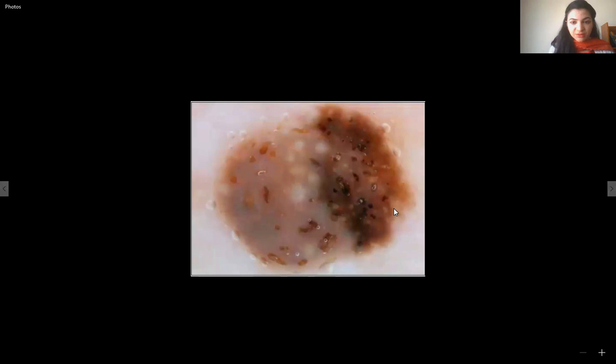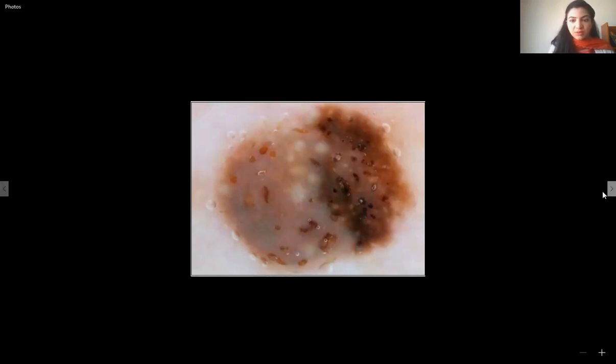This is essentially a revision: comedo-like openings, milia-like cysts, well-circumscribed. If you have these two features, just say seborrheic keratosis.